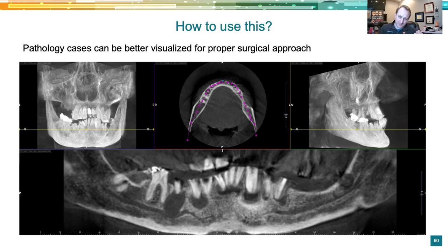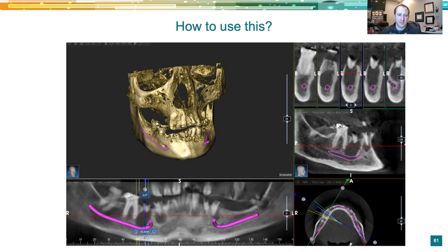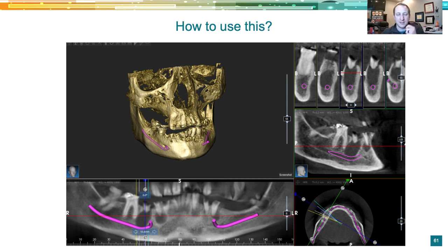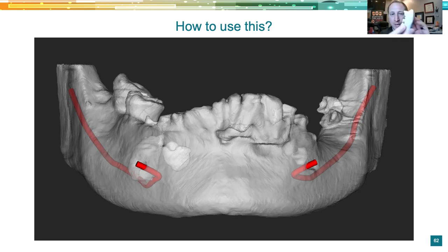What about pathology? Here we have a patient presenting with paresthesia on the lower right lip. The abscess from tooth number 29 is congruent with the inferior alveolar nerve — you can't even see the nerve border anymore. It's hard to know where the cyst stops and the nerve starts. This is the kind of case where consents get long, especially given the patient's existing transient paresthesia. To better visualize this surgical approach, we bone-segment the mandible. CBCT slices show the cyst rests almost entirely on top of the nerve canal.